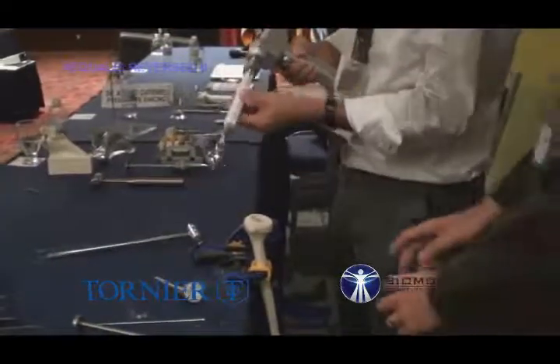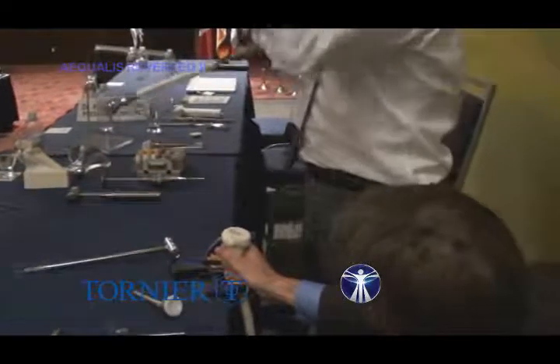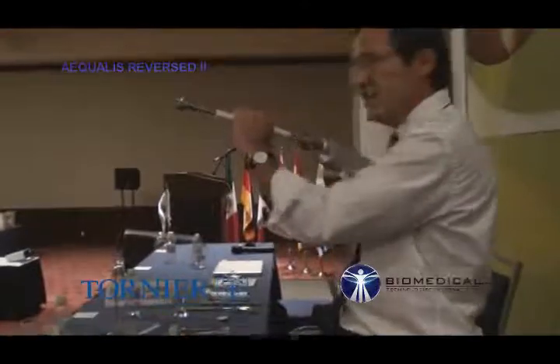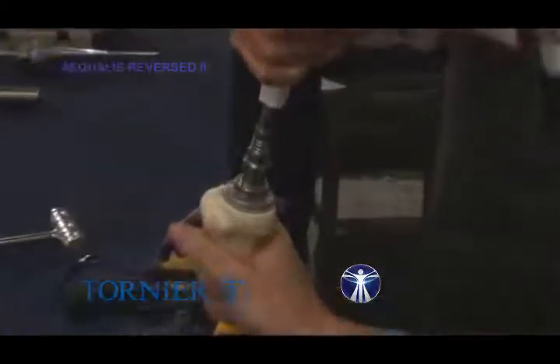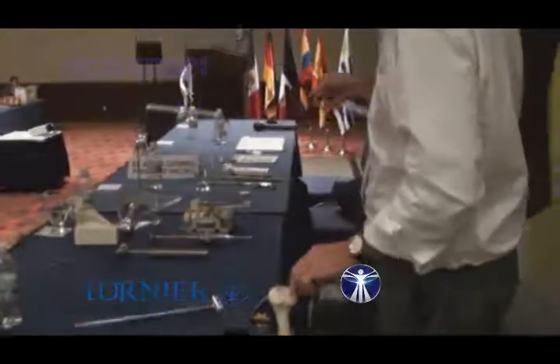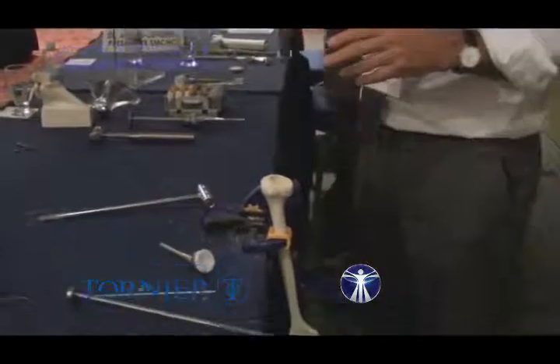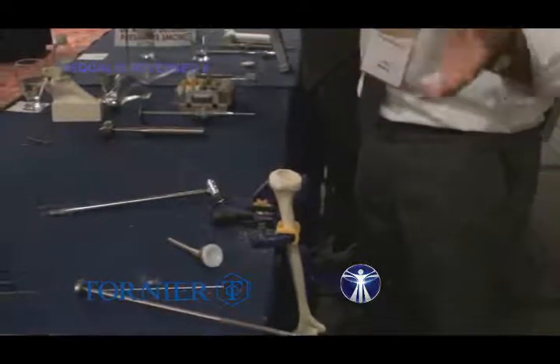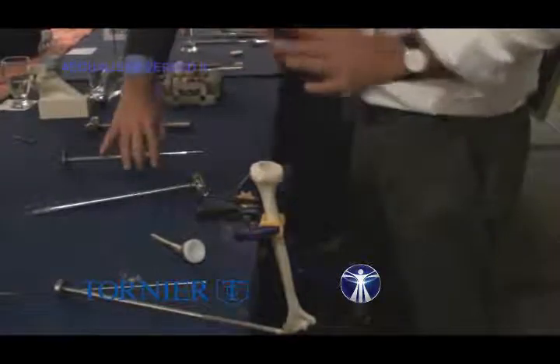Once the diaphyseal reaming is done, you have the epiphyseal reamer. To recap, there are three reamers: the first for the metaphysis, the second for the diaphysis, and the third for the epiphysis. The epiphyseal reamer is like an acetabular reamer — very easy. The rule is just to center it. You choose between 36 and 42: if it is a big man, use the 42 epiphyseal reamer; if it is a lady, 36 is fine.